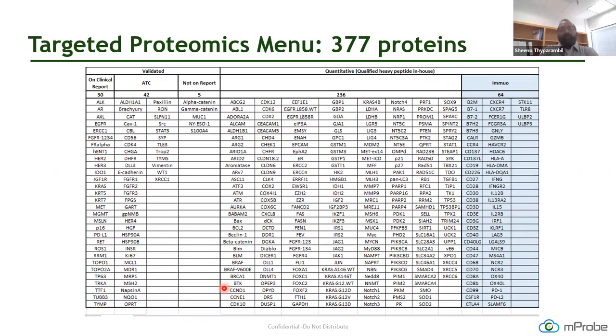So the experiments that we did, this was many years ago, and we were looking at a very small biomarker set. For those biomarker sets, we actually did not see that much difference. And the way we were trying to avoid that heterogeneity problem is, let's say we get a section of tissue and there is tumor spread out there, we would take out one pocket of tumor, and then go get another pocket of tumor, and combine all of them, because the sampling would be representative of the cancer that you have, right? So that we can say, these are the biomarkers we saw in this particular panel.